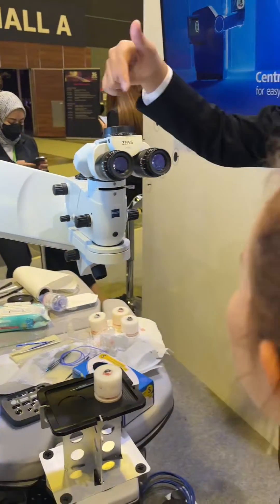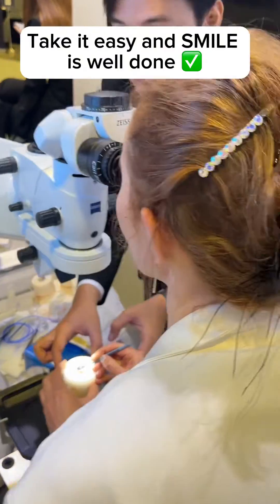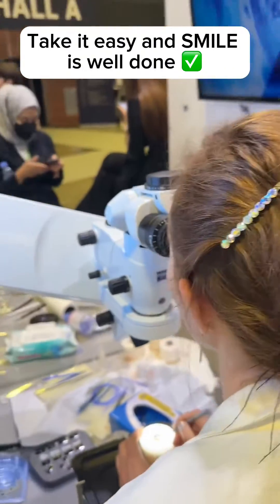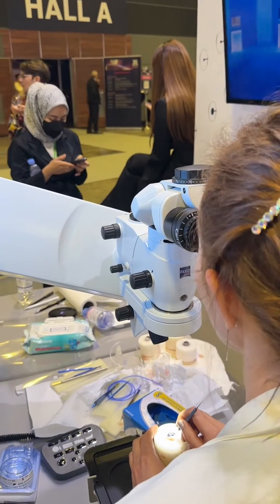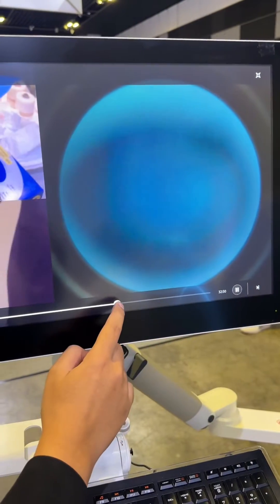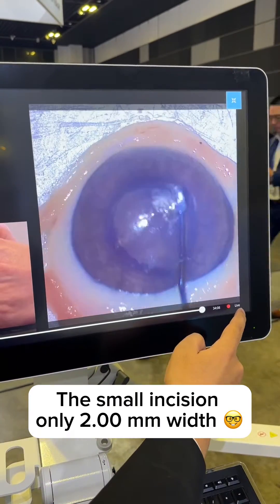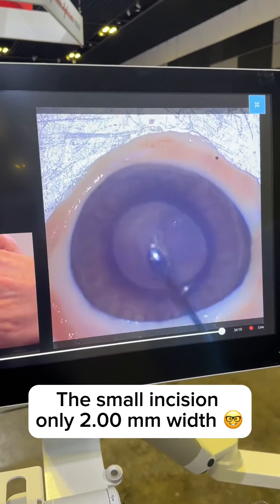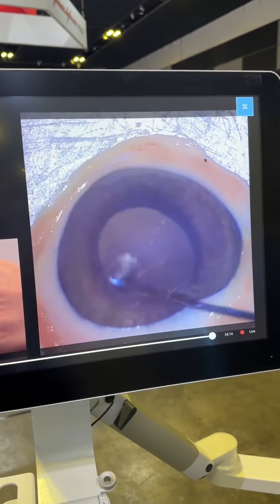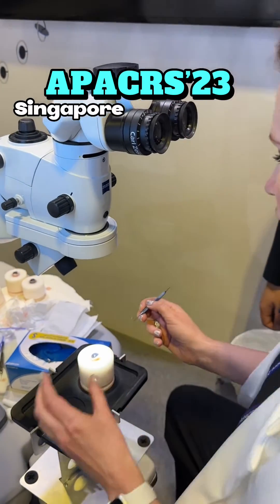So we can change the cornea. Okay, yeah. I want to take a video. Here, yeah, yeah. I think you need to do some addition to the video. Oh wow, very good.